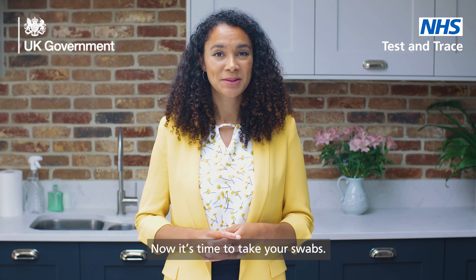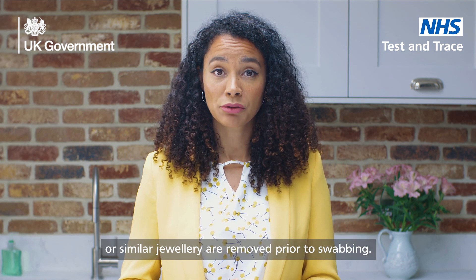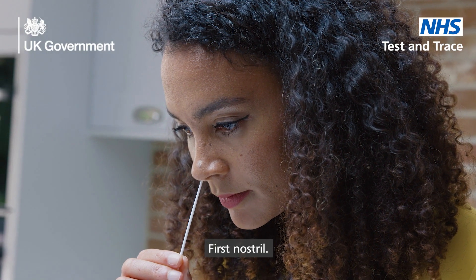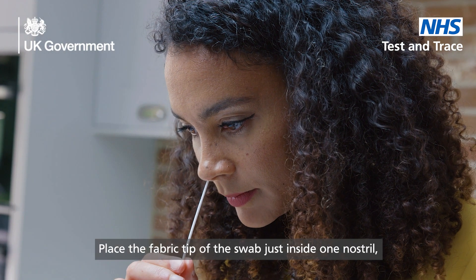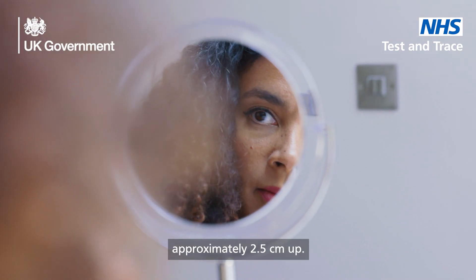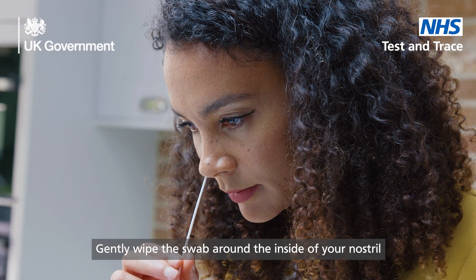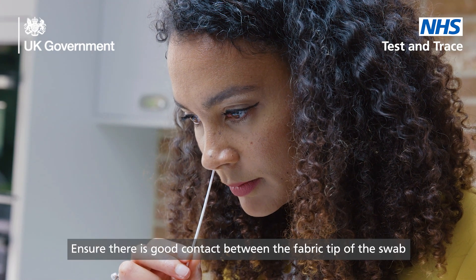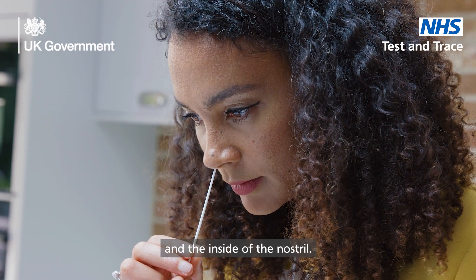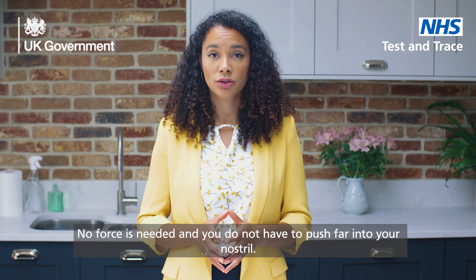Now it's time to take your swabs. Please ensure all nose piercings or similar jewelry are removed prior to swabbing. First nostril: place the fabric tip of the swab just inside one nostril, approximately 2.5cm up. Gently wipe the swab around the inside of your nostril in a circular motion five times. Ensure there's good contact between the fabric tip of the swab and the inside of the nostril.